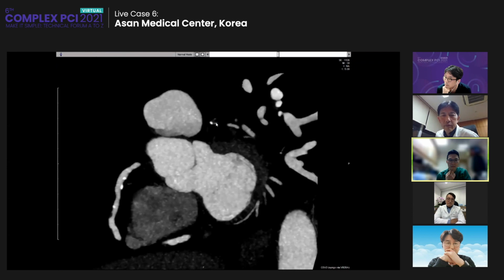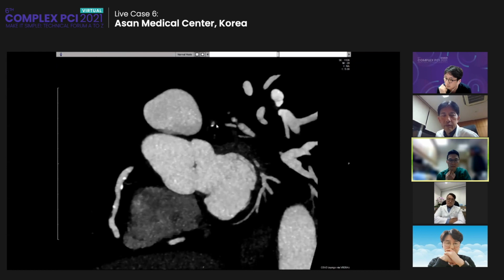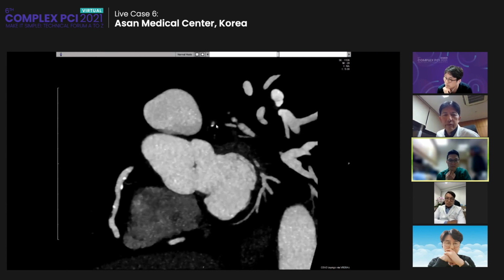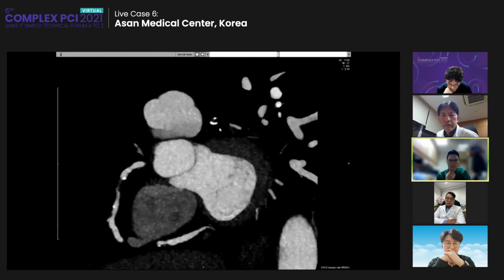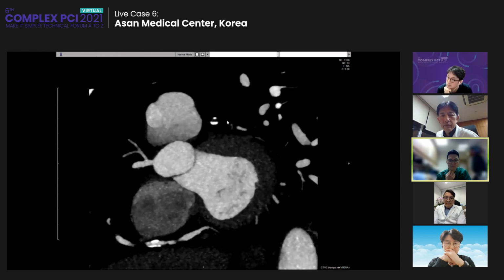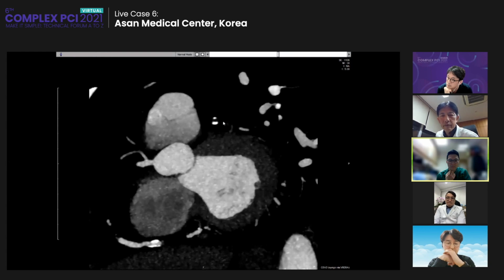That means that it is wise to access just the mid portion of the proximal cap to access the CTO lesion itself. The good part is that I don't see dense calcium at the entry portion, and the calcification at the CTO segment itself is actually a superficial calcium, and the mid portion of the CTO segment has some soft tissue, which is a good signal for wiring.